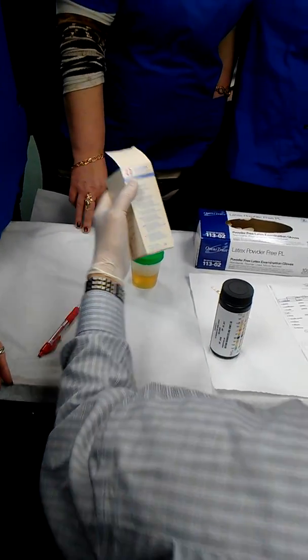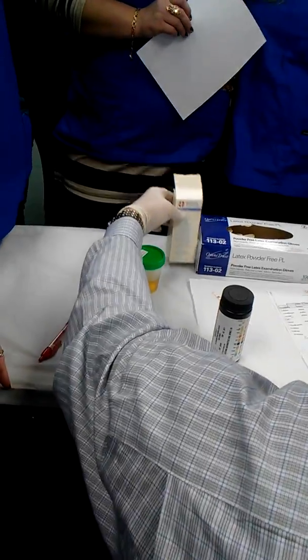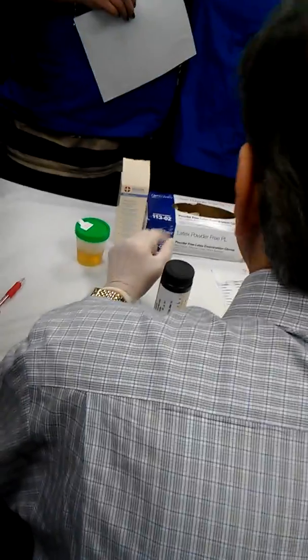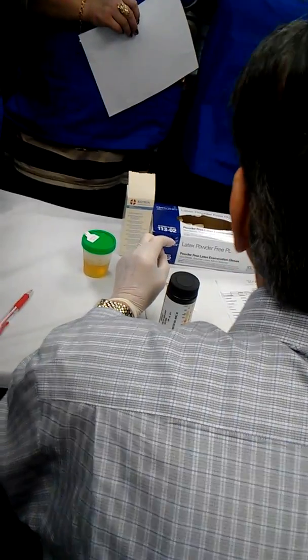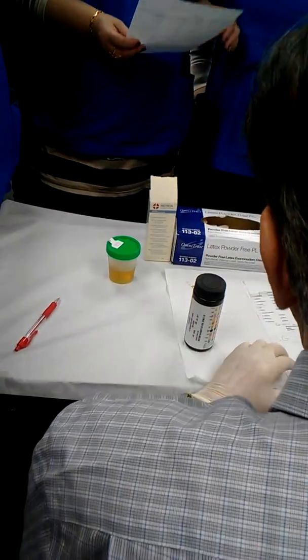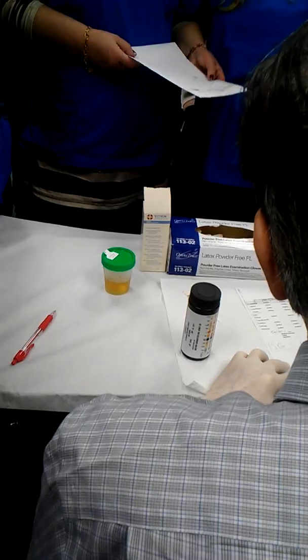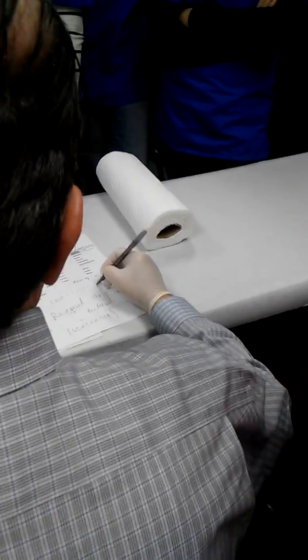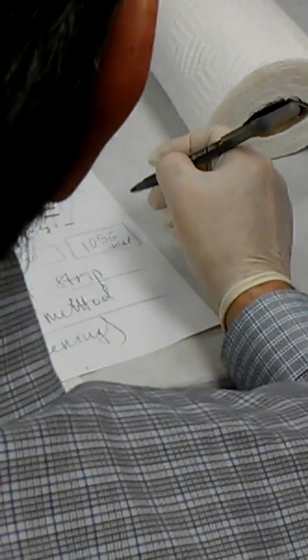But one thing, specific gravity, is a physical thing, not chemical. Other things are chemicals. That's why sometimes you will see a 10 SG test, right? So what does 10 SG test mean? It means 10 parameters, of which one is SG, specific gravity.